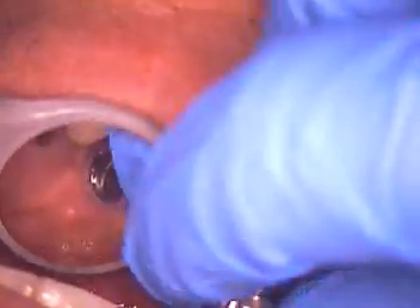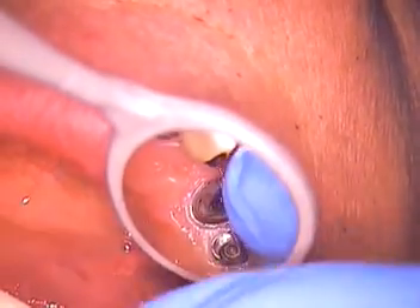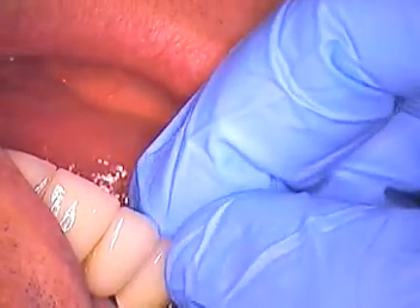That's the angle — that's down all the way. A little bit of blanch. So we'll go to number six to try in that crown. There's our crown on six. I'll tip you back a little bit. We're below the gum line here, so I need an explorer. There we go.